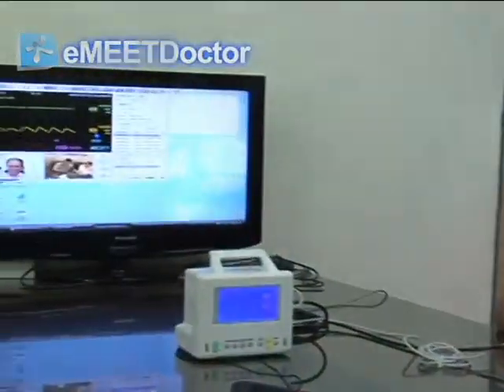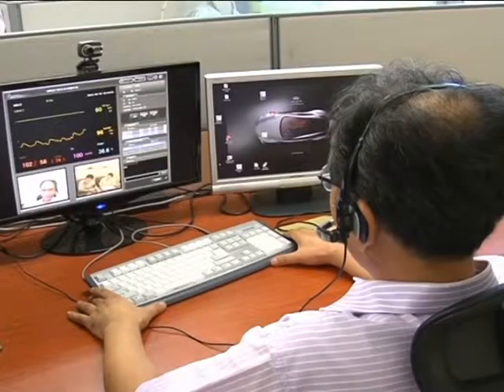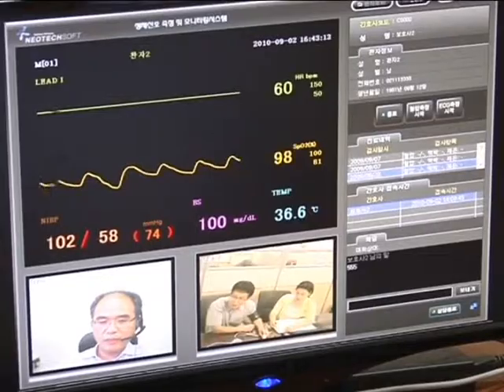These data can be recorded and replayed. The doctor can also refer to historical data.